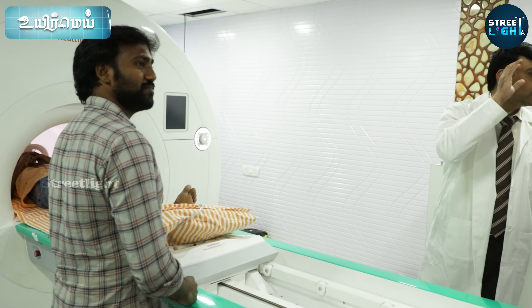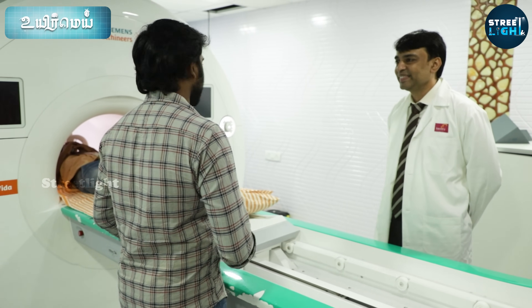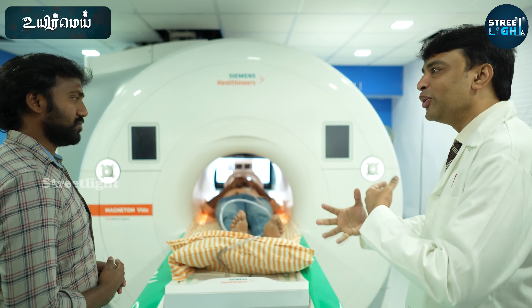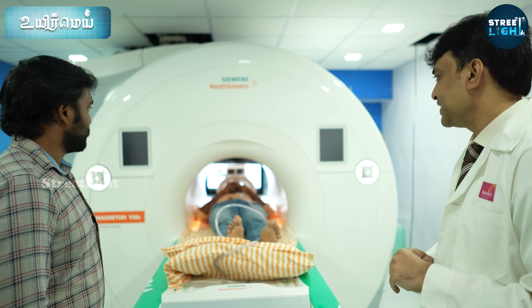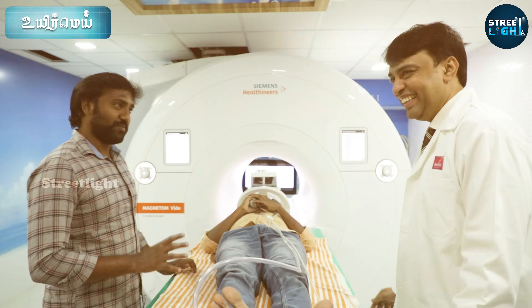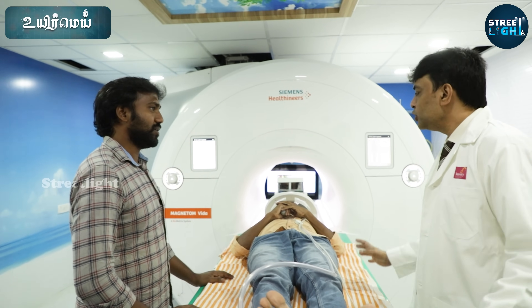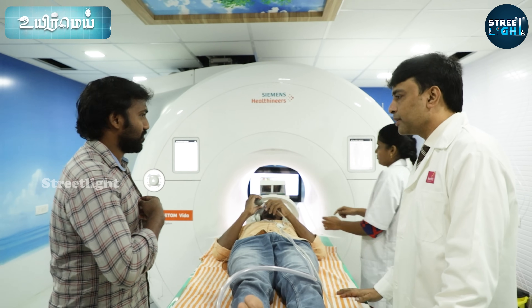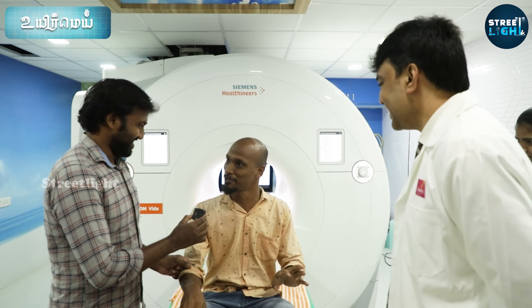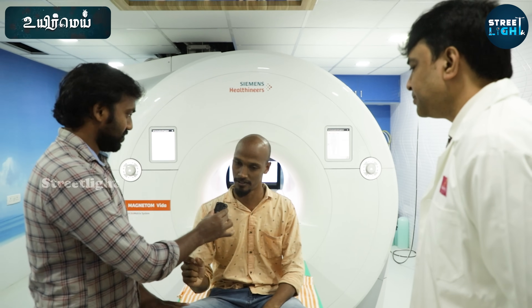The music is actually the scan sound alongside actual music. We can scan and hear the sound. It's a very different experience. The patient can feel a little bit of vibration. I feel like I'm wearing a headset with light music. The sound from the scan is very noticeable — like a loud knocking.